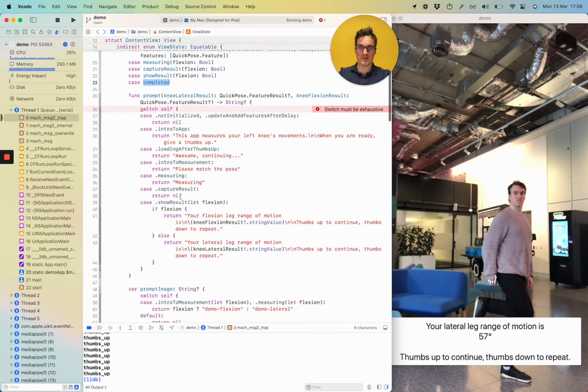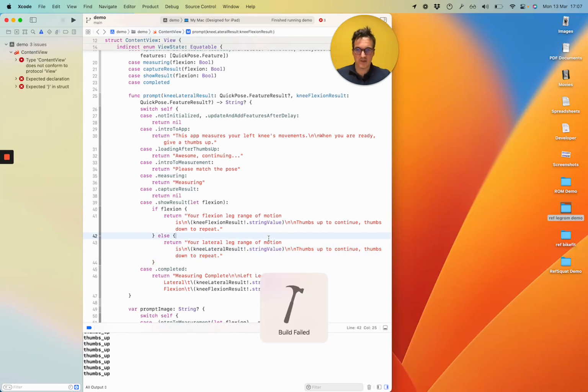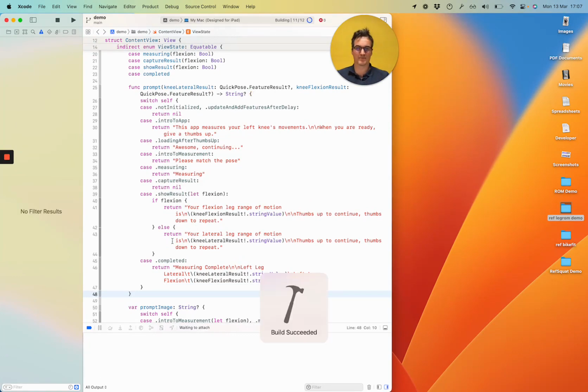So we're going to add a value here, and this is going to be quite a big message. I'll just copy it from my notes. Okay, so measuring complete, new line, left leg result, and then left leg result for the other measurement. We want that to be inside the switch. Okay, right, let's see if that runs. Oh, done something wrong. Ah, yes. Cool.